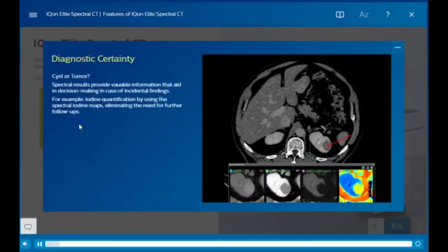Radiologists are often faced with situations in which the image doesn't give them a clear idea what they are looking at. A very common example is a renal lesion as found in this image. It is easy to find, but the referring physician wants to know what it is. This is important to determine the course of treatment. If I would only have done a non-contrast scan first, I could have compared and determined whether the lesion is taking up iodine. I've picked the wrong protocol.